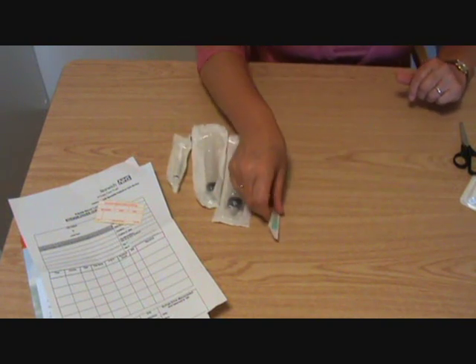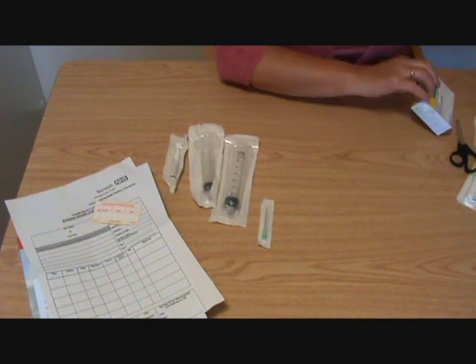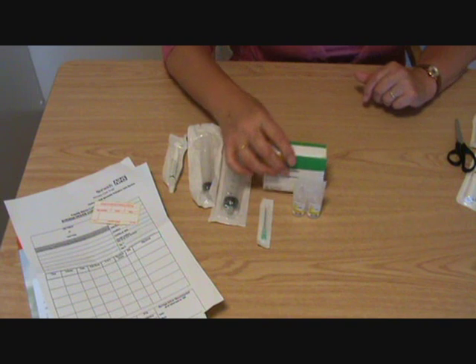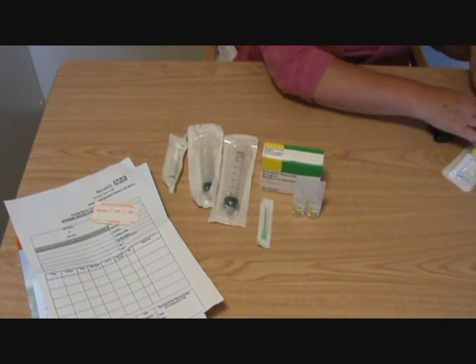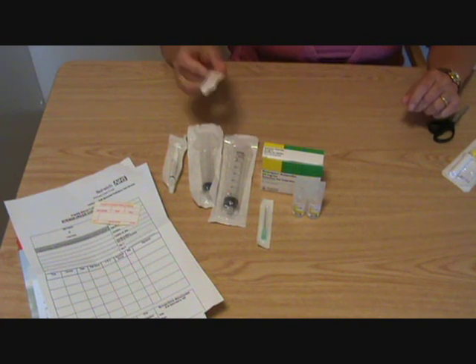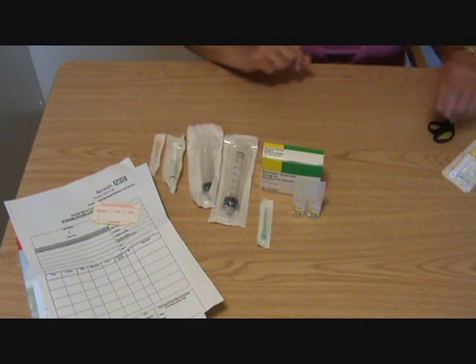You'll need to have a needle for drawing up the drugs. You'll need to have the carrier solution, the diluent, and you'll need to have the drug itself. We also carry small subcutaneous injections just in case you might want to give a stat dose before setting up the syringe driver.